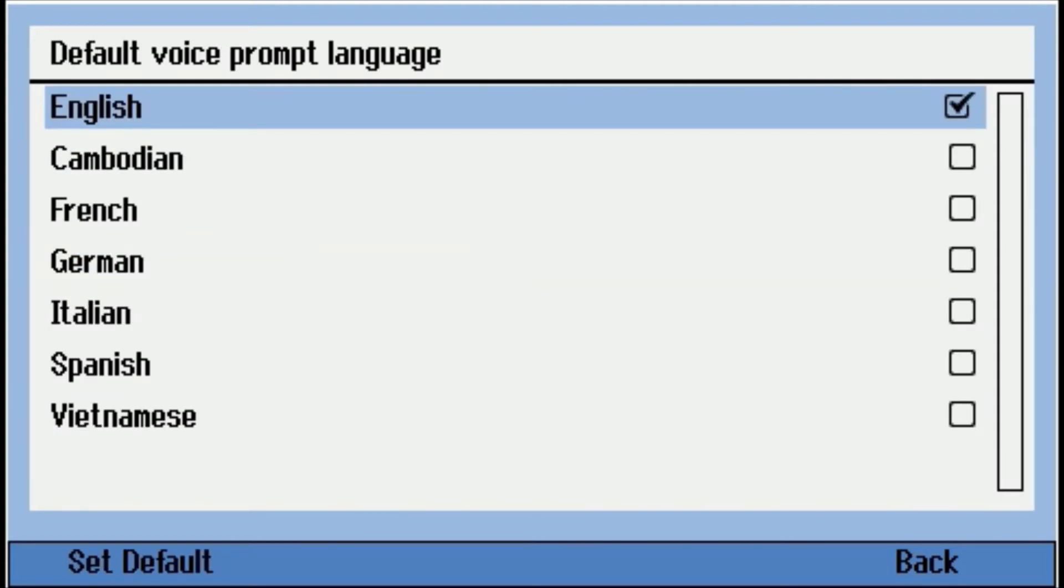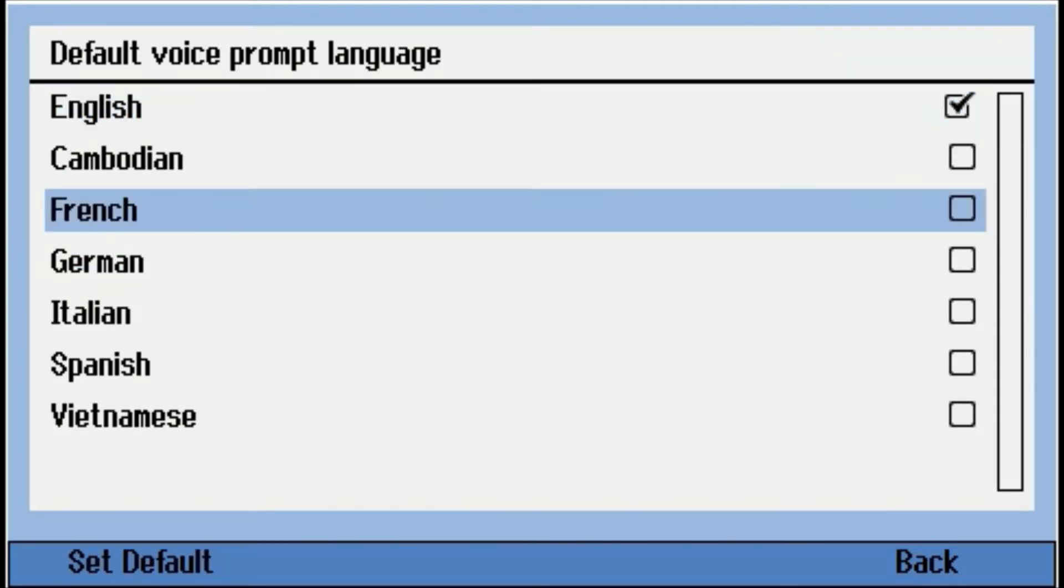So you can see English, Cambodian, French, German, Italian, Spanish, Vietnamese. So these are the languages that come in the audiometer. Here you can change the default.